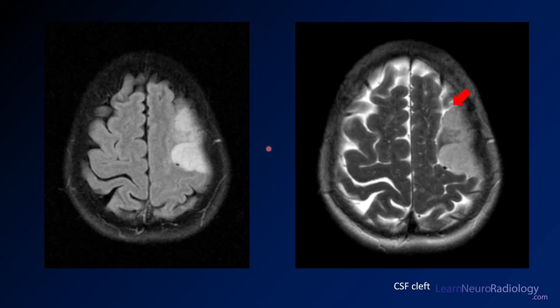Here you see the FLAIR image we saw before, showing this extra-axial mass along the left convexity. On the T2 you can make out the CSF cleft — the CSF space between the tumor and the adjacent brain — which indicates you're probably looking at an extra-axial mass. Here you also see a dural vein that's probably displaced away from the calvarium, again suggesting an extra-axial mass.